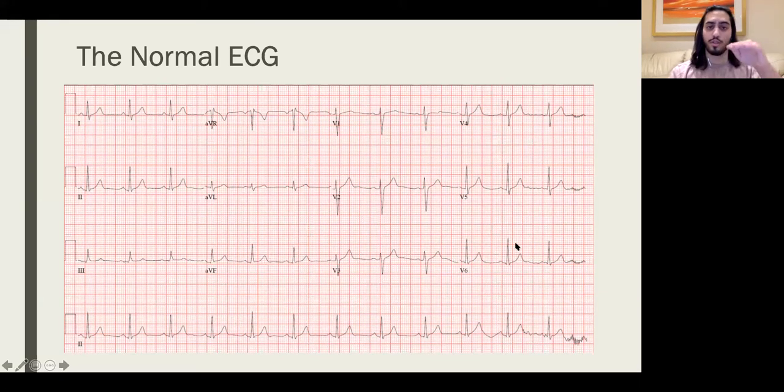Let's see how the chest is doing from a transverse view. Okay, now just to summarize, at the end you'd be asked to summarize the whole ECG. So I'll just demonstrate this for one example. If we're using this ECG, this is a 12-lead ECG of patient X with the date of birth and patient details of whatever, taken at today's date at this time.